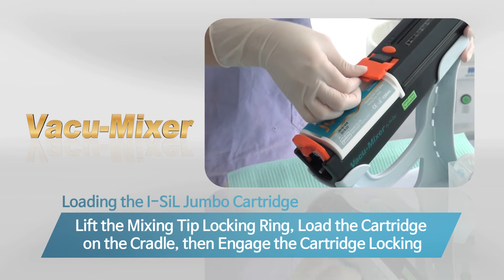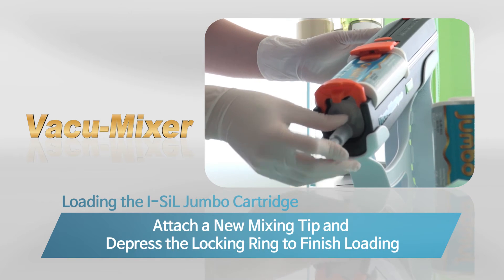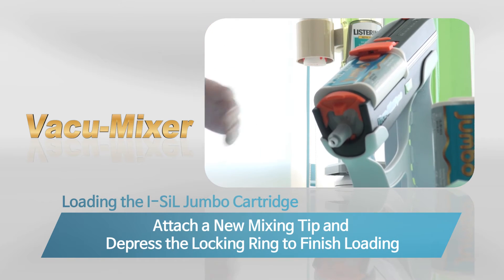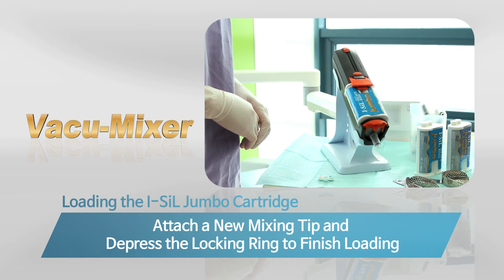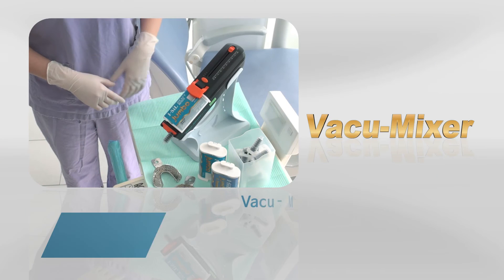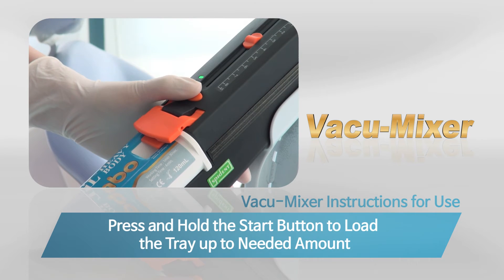Place the I-SiL Jumbo cartridge headfirst into the cradle, then secure the cartridge latch down into the lock position. Attach a new mixing tip and depress the locking ring to finish loading the I-SiL cartridge into the Vacu-Mixer.